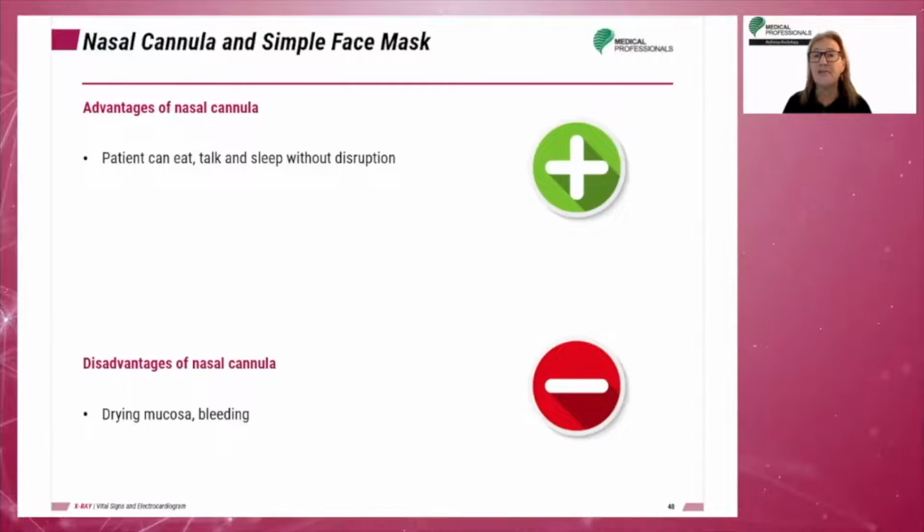The advantage of the nasal cannula is that it is easily tolerated by patients. The patient can eat, talk, and sleep without disruption. A major disadvantage is that regular use will result in drying of the mucosa or nose bleeding.